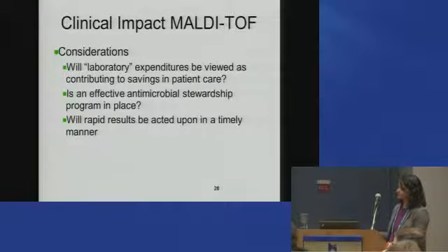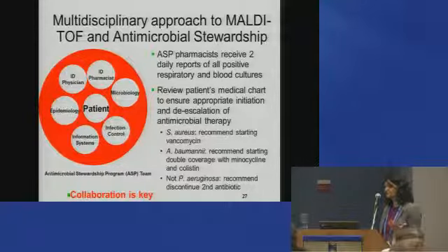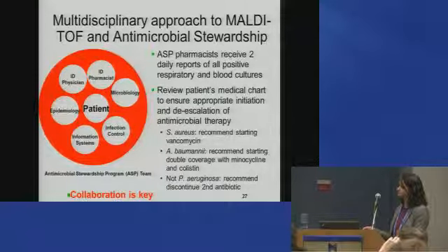This is all regarding patient care, that all of us are here as part of team members. It's a stewardship team. We meet once a week, and we go over all our issues and problems with drug resistance and getting answers and trying to see how we optimize doing the things that are going to benefit patient care. So what we did when we started to work on MALDI-TOF, we had a plan where we would be sending our ASP pharmacists 2 daily reports of all positive respiratory and blood cultures. And the pharmacist would then review the patient's medical charts to ensure appropriate initiation or de-escalation of antibiotics. So that would be their job.